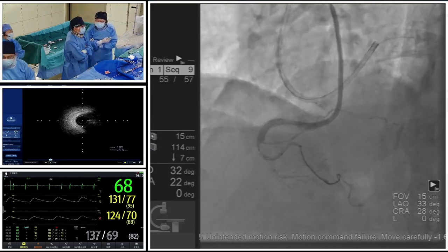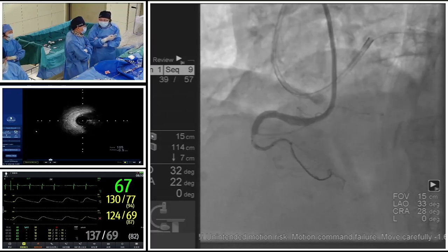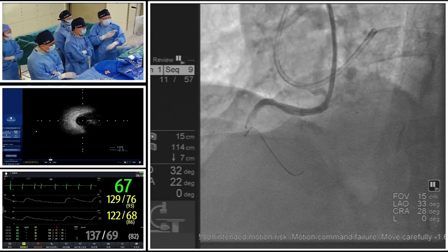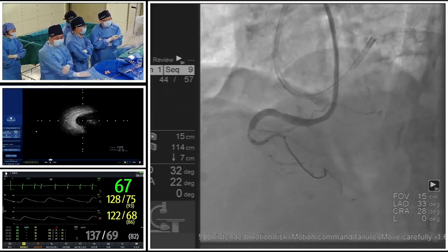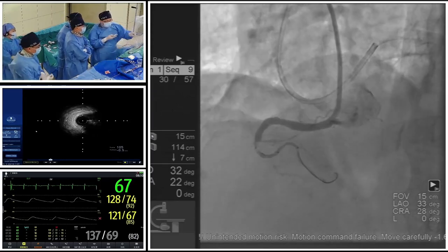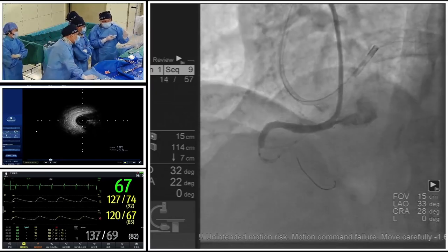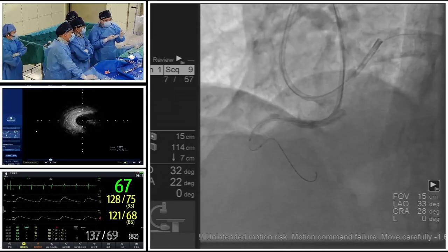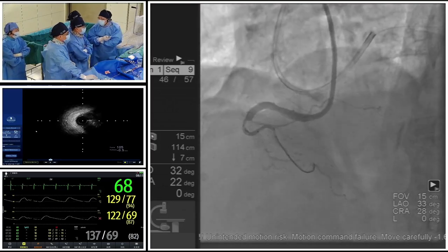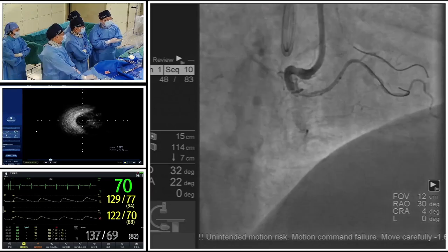Professor Li, okay, so the IVUS already shows us where the proximal cap is. Another thing we should do is an angiogram when the IVUS transducer is just at the ostium of the RCA proximal cap. The angle should be a little bit to the side branch, maybe 5 millimeters. And this is very important information. And then this is another view.